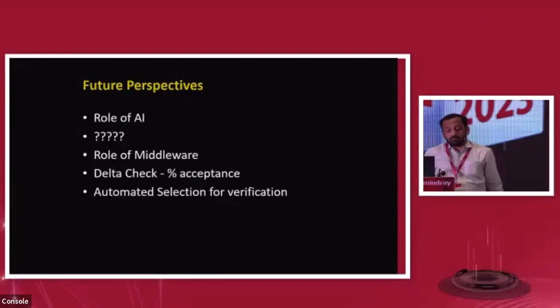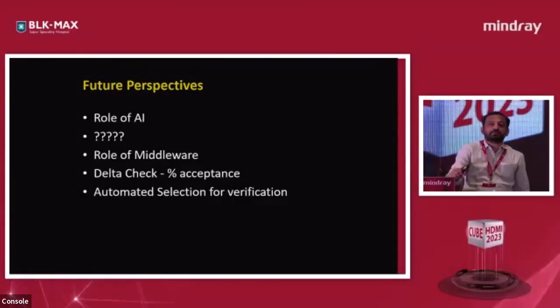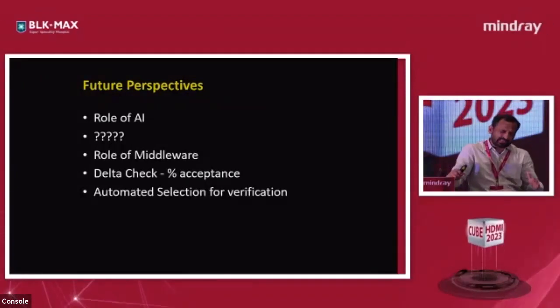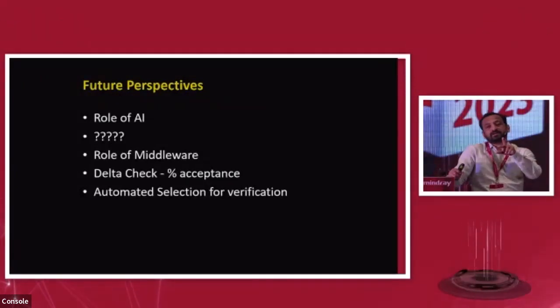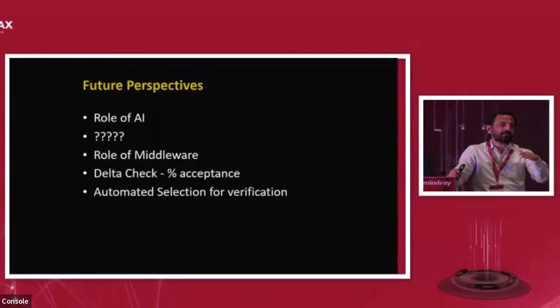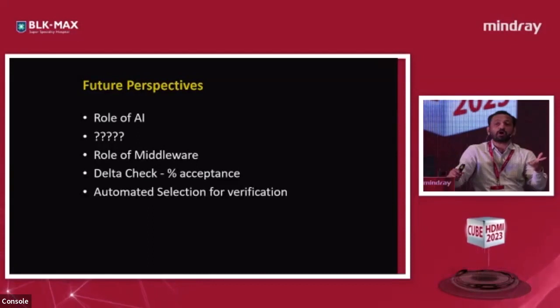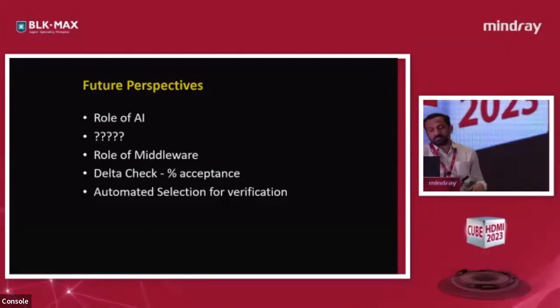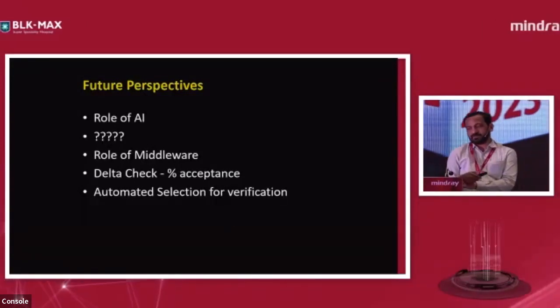And for delta checks to be applied for MPV, there are no accepted values for the delta check, whether to be accepted on the value-based MPV or a percent difference. And that can be used for automated selection of verification.